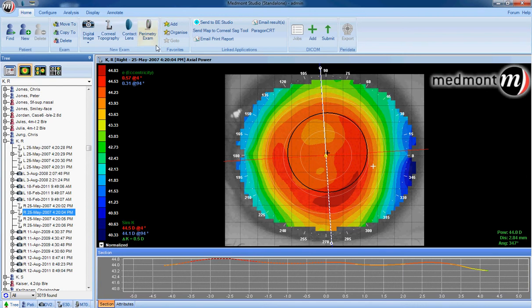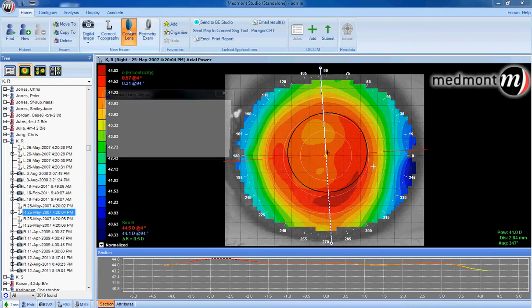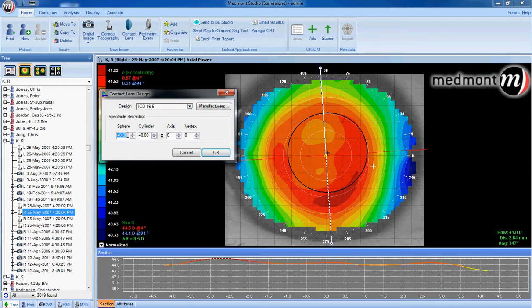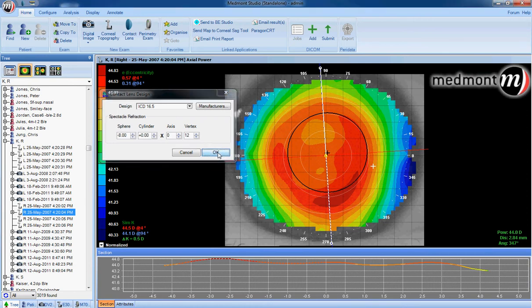Once you've chosen your best image, click on the contact lens icon and select from the design window the ICD 16.5 millimeter lens. You can key in the spectacle RX and vertex distance, then click OK.